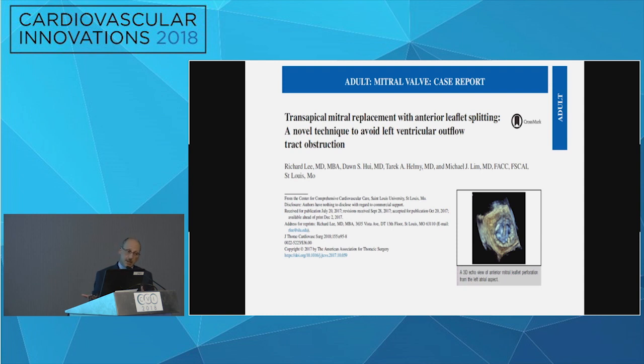And as we develop the transeptal approach, this would be one extra step, just penetrating the anterior leaflet and ballooning it. And then you deploy your valve as you usually do, and then you really don't have to worry at all about any LVOT obstruction potential.